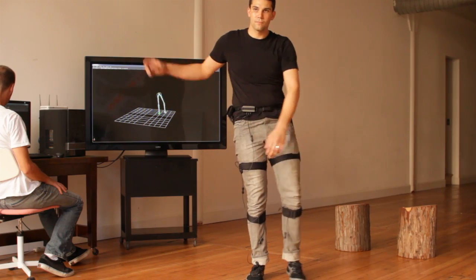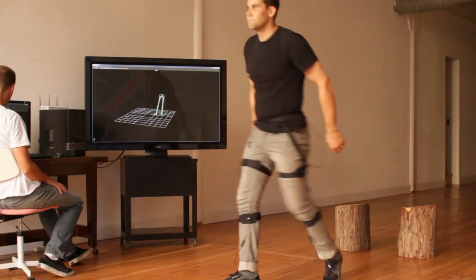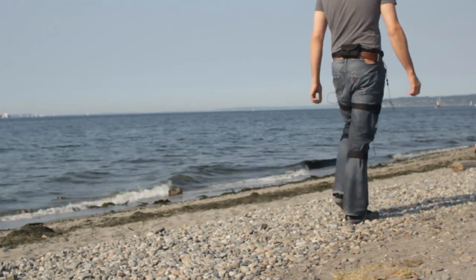Because Shadow's sensor technology is inertial, this system requires no cameras and it can be used anywhere. Record human body motion outdoors, at the park, on the street, or at the beach. You are no longer limited to capturing indoor environments.